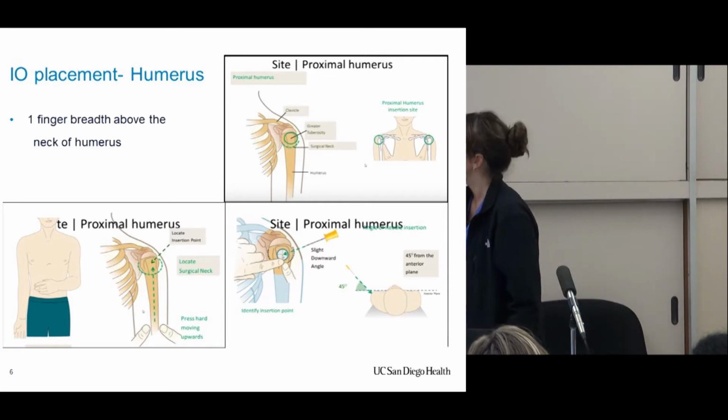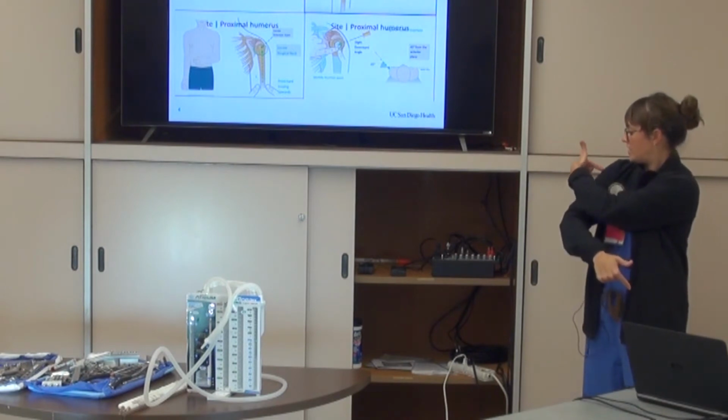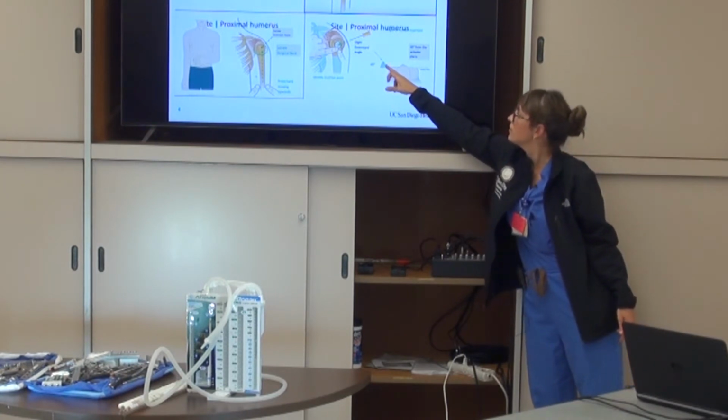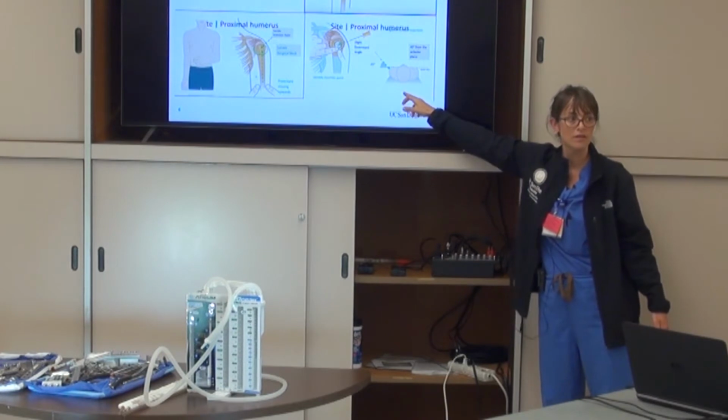The angle is fairly important. So you want to be perpendicular to the skin, and you're aiming, they sort of show it here. See, so you're sort of going from anterior to posterior. So you're actually aiming toward the scapula posteriorly. Make sense? Okay.